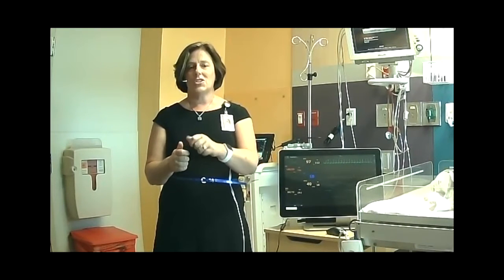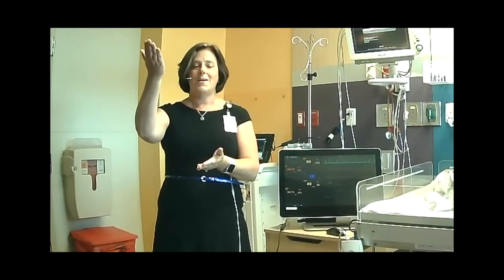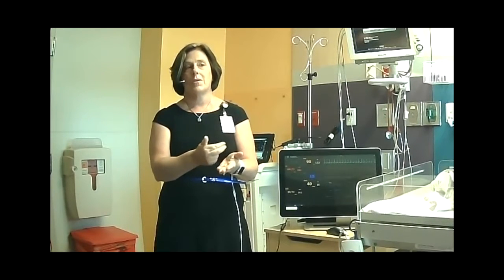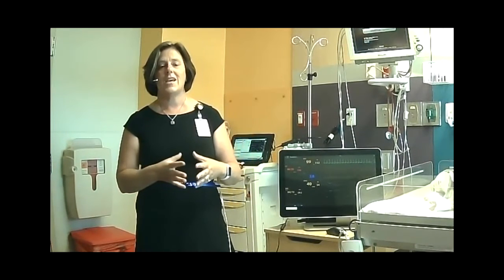So you'll see the nurse be what she calls zeroing. What she's doing is turning it and making it open to atmosphere, saying that's 0. So when I turn this, what pressure do I feel? Okay, and that reads blood pressure. So it's a very nice line for us to continually say, okay, heart rate's this, blood pressure's this.